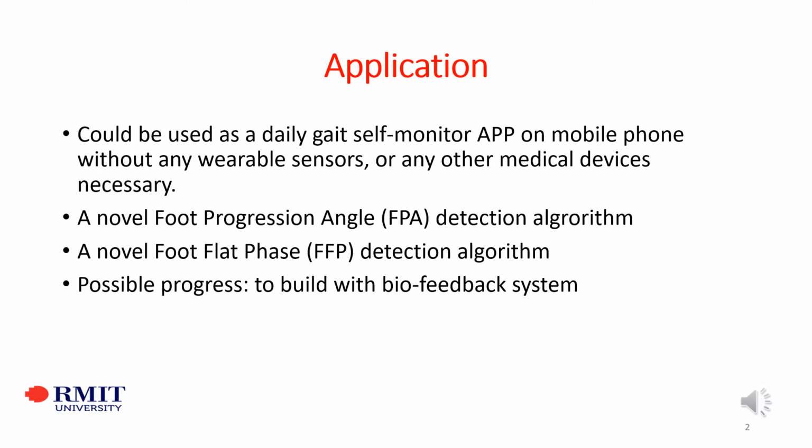This application could be used as a daily gait self-monitor app on a mobile phone without any wearable sensors or any other medical devices necessary. This application includes a novel foot progression angle, we call it FPA, detection algorithm, and a novel foot flat phase detection algorithm. It possibly can be developed with a feedback system.